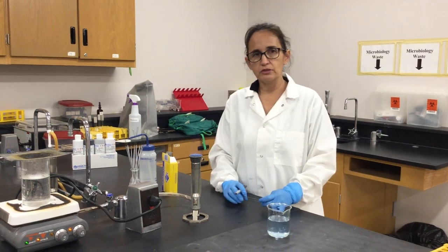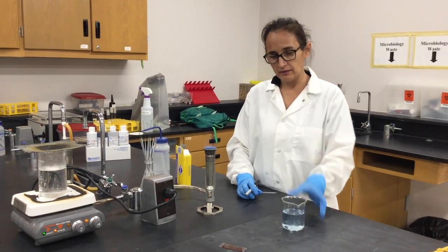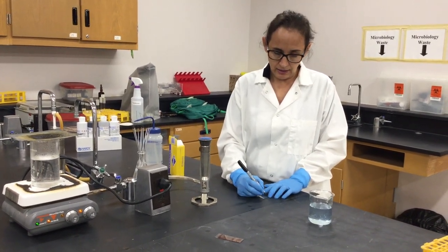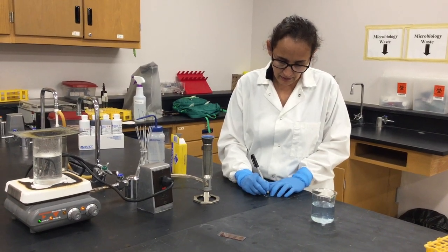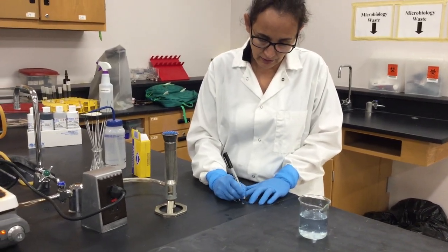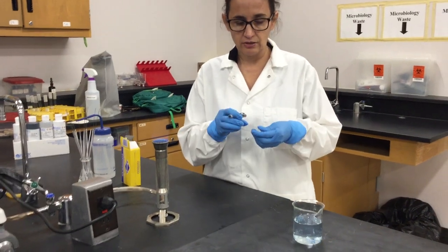In this video, we're going to see a demonstration of how to make a gram stain from the gum line. And just as before, you just have to put the technique that you're using. So in this case, it will be gram stain, on the glass slide. And then your initials and the date. You do it there on one edge of the glass slide.